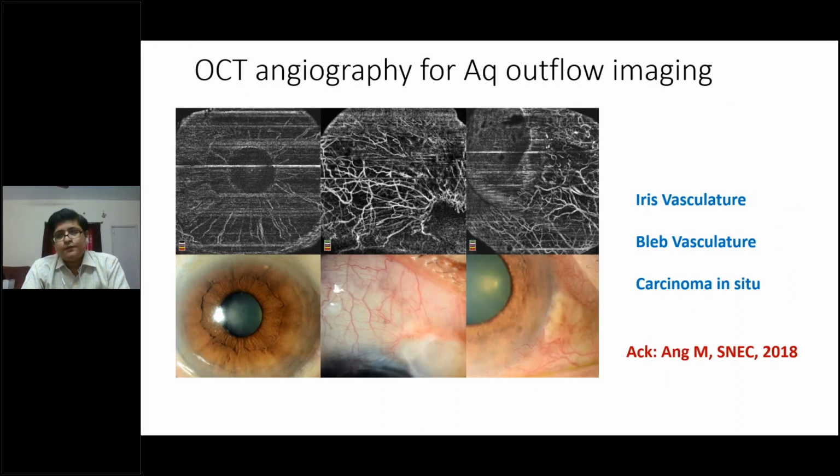And with OCT angiography, we have started looking at the blood vasculature and how the healing happens, more for research purposes, but it may become a part of clinical practice in future if it is made easy, and algorithms are there to define which kind of blebs will go in for failure, and we may be using it for management purposes as well. I think there is a lot more to come in the future, and we look forward to more technology assisting us, and probably giving us more work actually. So we should keep abreast with this, and I hope such seminars will be of very good help to keep us abreast with the future technologies.